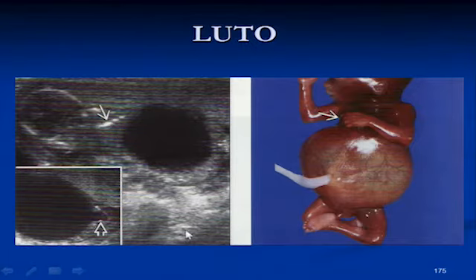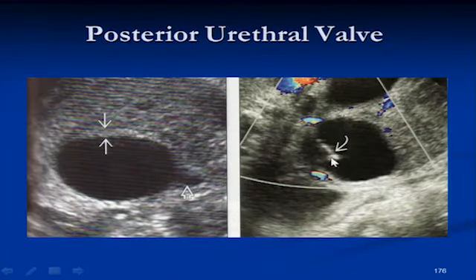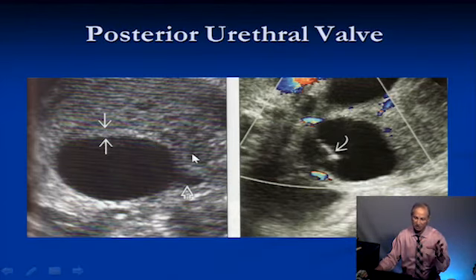When you look carefully, here is the bladder, you can see the proximal urethra is dilated, and that's called keyhole appearance. That's characteristic for a urethral obstruction, called keyhole because the distal urethra is closed completely, the proximal urethra will be dilated. And this is a catheter here inside the bladder draining it out. Usually the bladder wall will become thick because it will try to overcome the obstruction and then kind of give up after that.